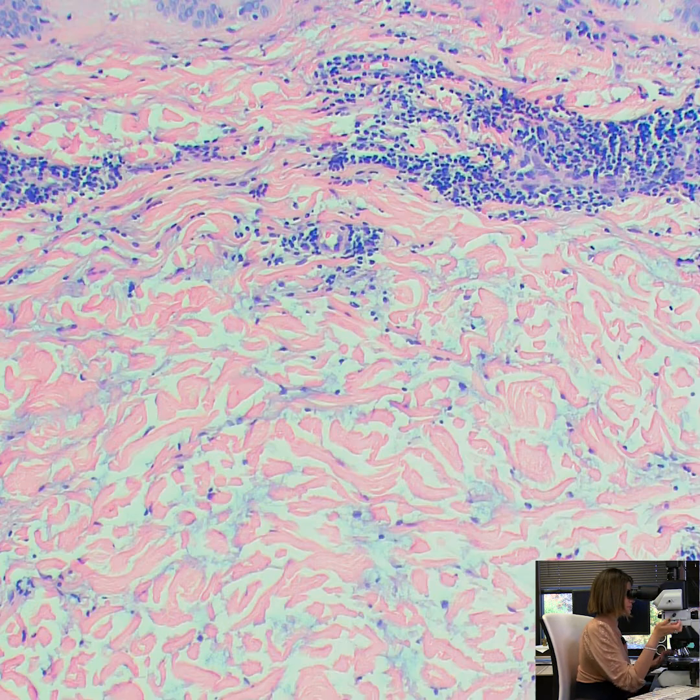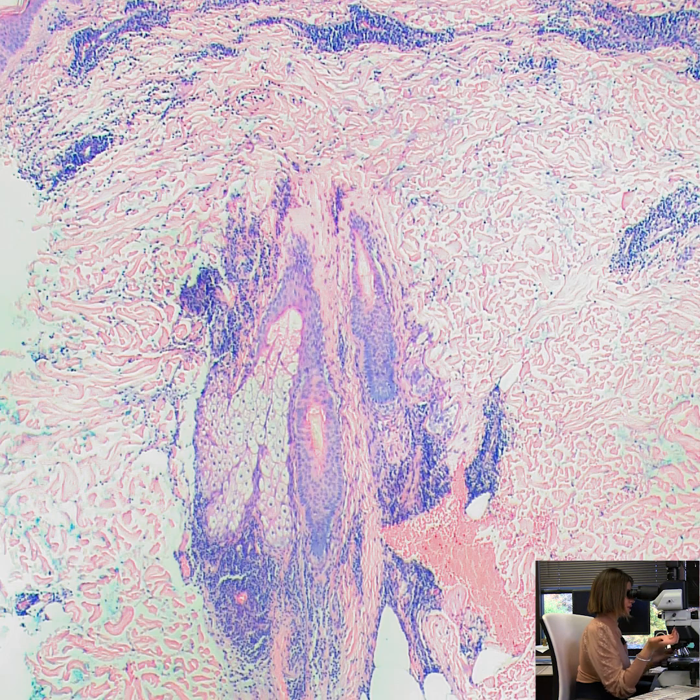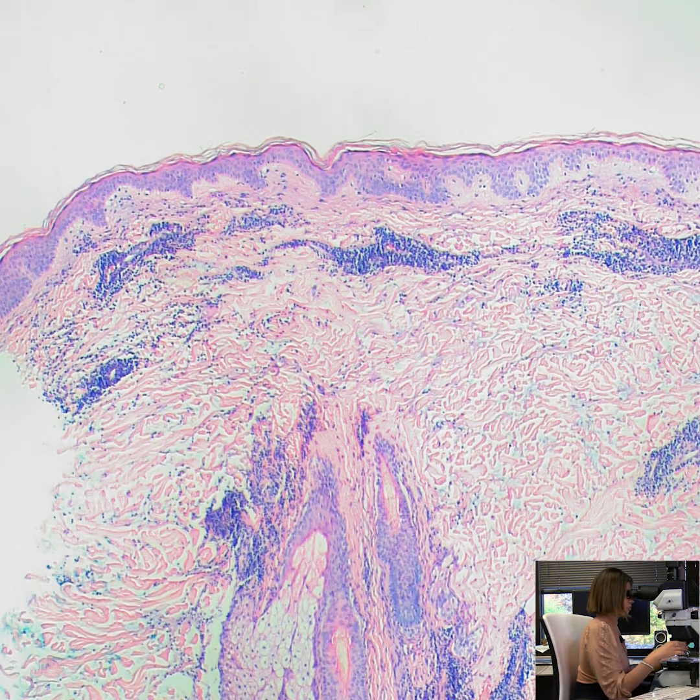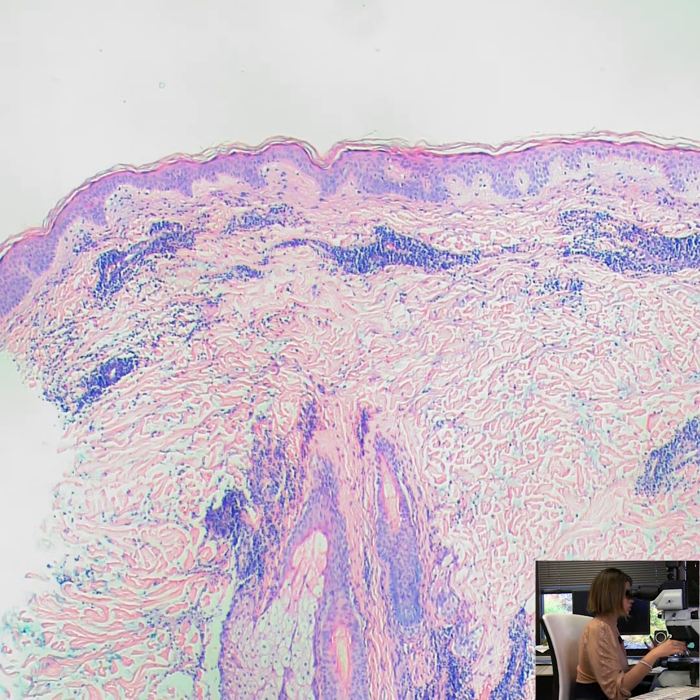When you look at the biopsy, it is more diagnostic for its superficial and deep perivascular lymphocytic and perifollicular inflammation. On second thought, you will go and check for mucin. The lymphocytic infiltrate is more impressive, and then you go on high power and confirm that, yes, there is interstitial mucin.